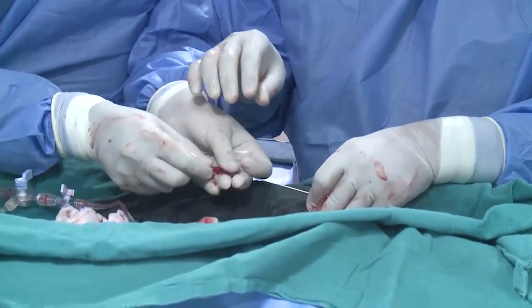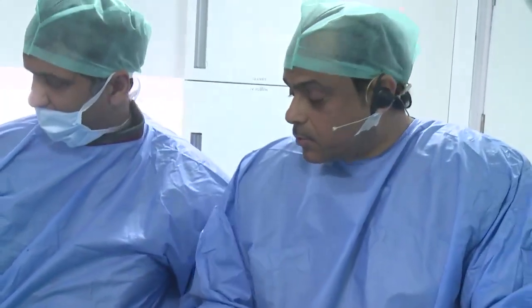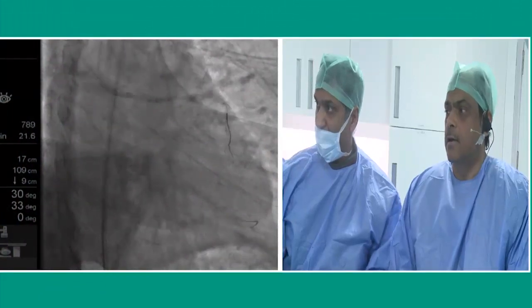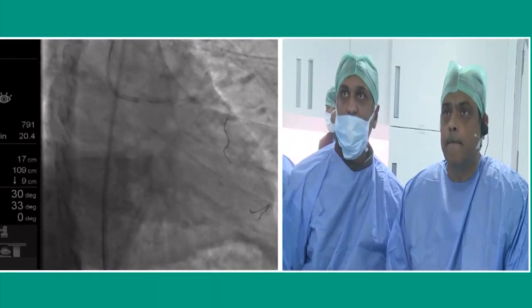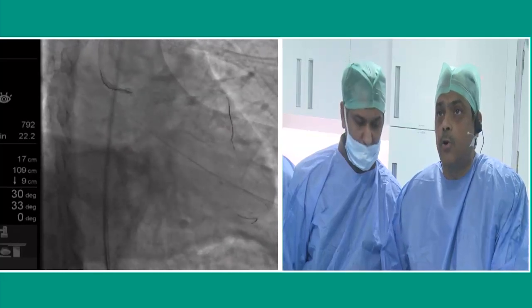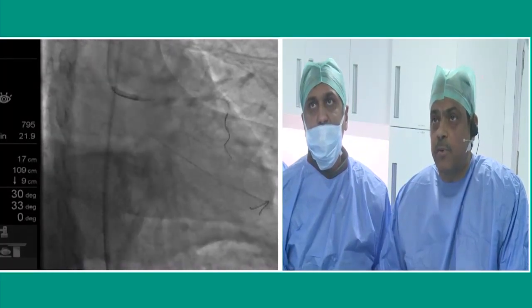Get the second wire coming. Agree, most likely. So I'm trying the 3rd time. Let's see what happens. You needed to stay very, very distal, because I'll go to the LAD, and one additional cell distally to the ones that we crossed before. I'll go to the first LAD and then come back and pull back from the LAD. This is what I'm trying.